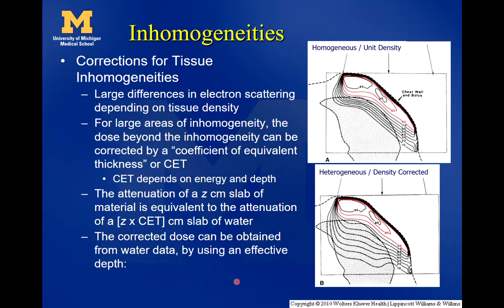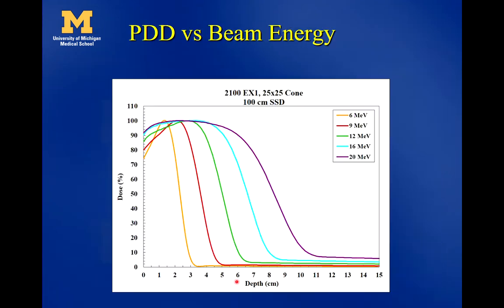And it says here the correct dose can be obtained from water data by using the effective depth. In this day and age, I'd say just use Monte Carlo to calculate it. I probably should have put these slides much sooner.